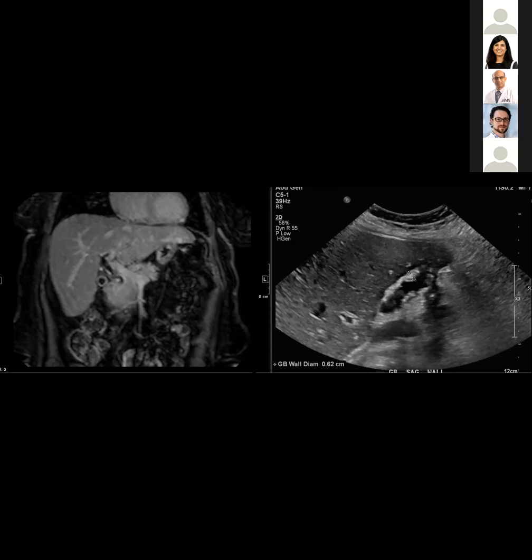It's obviously really dependent on everyone's workflow. And of course, we did start with just a few cases a month that came on my day on ultrasound. But now we have probably about a quarter to a third of our abdominal ultrasound sonographers, radiologists, and all of our ultrasound radiologists at least comfortable with obtaining images and checking them for quality. And then if they can't figure it out themselves, they save the images and call me up, which, I'm reading this one remotely with one of my colleagues over at the county hospital while I'm here at the university side.